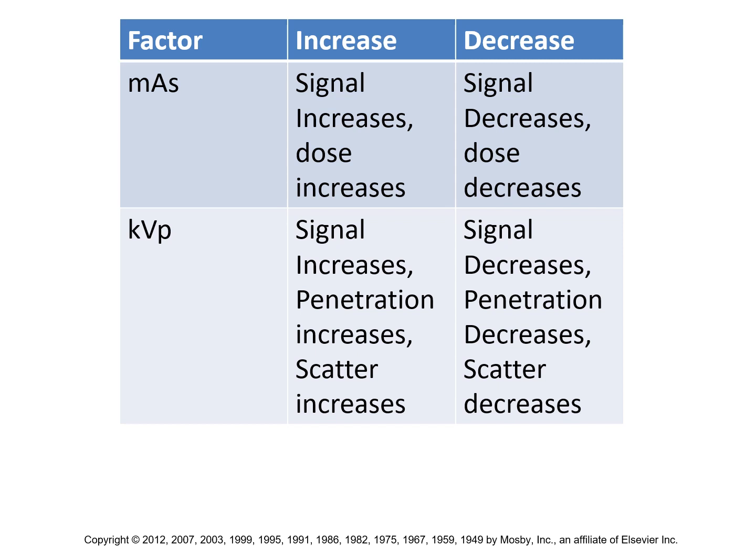KVP, you're going to get a stronger signal, so you're going to create an adequate image with more KVP, more penetration power. However, you're going to increase the amount of scatter radiation. The grid only cleans up so much. And so you're actually going to introduce more randomness into the image, and the image is going to start to look muddy or grainy. It's going to look like it's got random information in it.